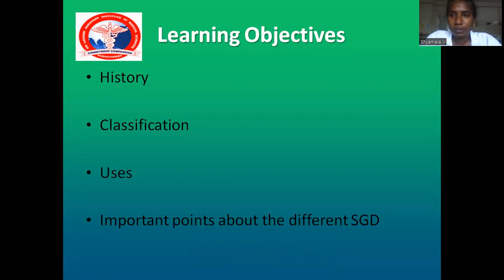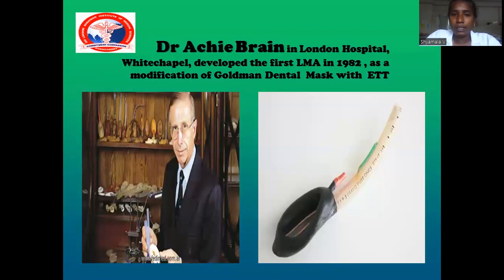what we are going to see in this class. We are going to see the history, how the LMA supraglottic airway device has evolved, its classification and uses, and important points about the different supraglottic airway devices. Then the history is an important one-mark question for your exam.